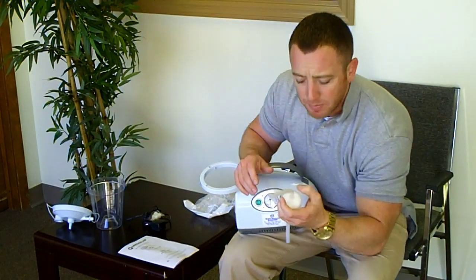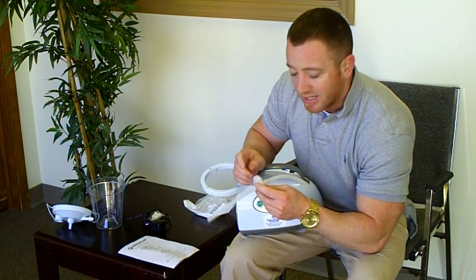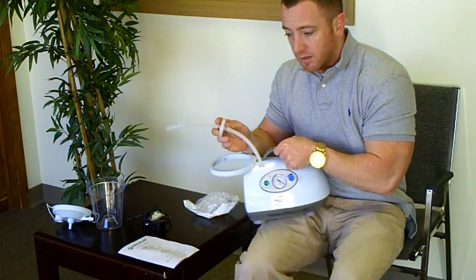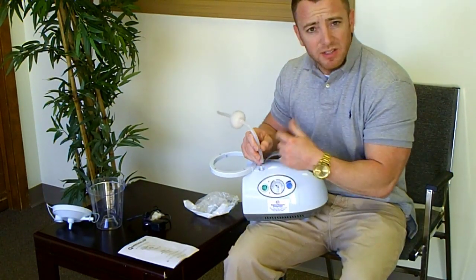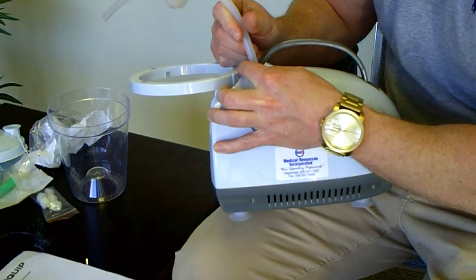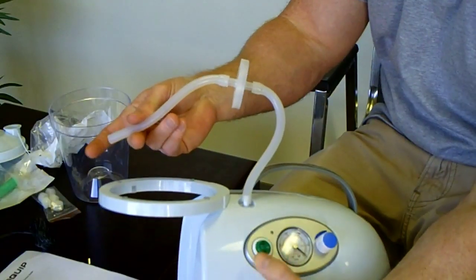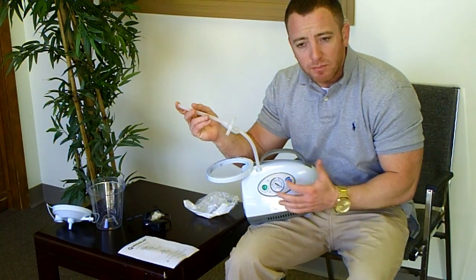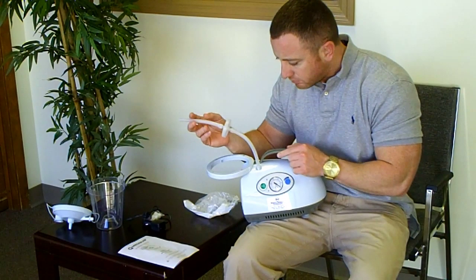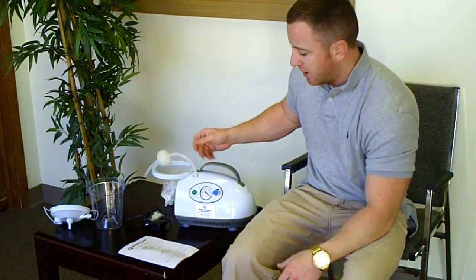On this filter in particular that it comes with, on one side it says in, on the other side it says out. That's the way that air needs to flow. So it needs to flow in, out, because it's sucking towards the machine. So the next place you would check it would be here. If it pulls your finger in and the gauge goes up, then it's working fine. That's not your problem. Your replacement filter should look something like this, and it doesn't matter which way it goes, unlike the filter that comes with the machine.